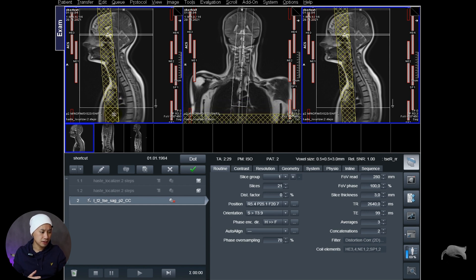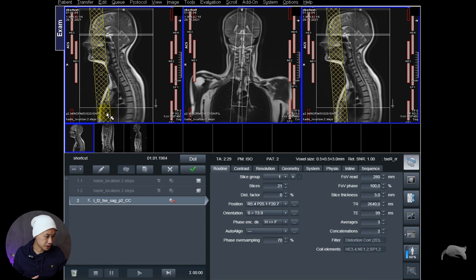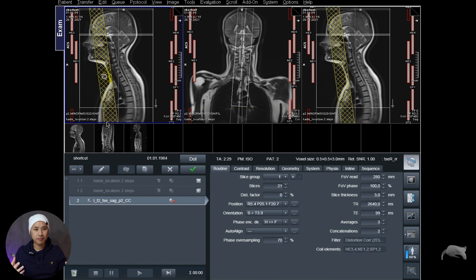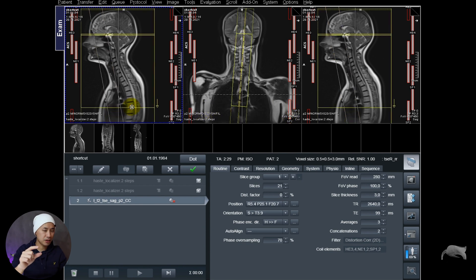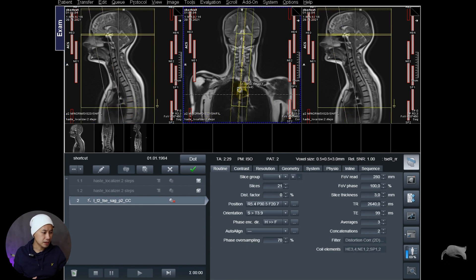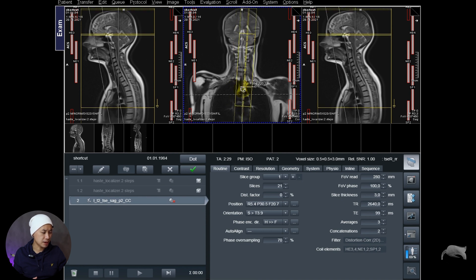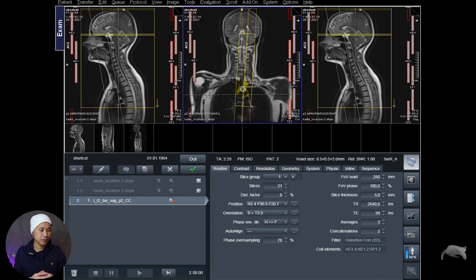When I hold Shift, I get another icon — as you can see, there's a rotation icon and a movement icon at the same time. So it's very fast; you don't need to push here, move your mouse, push back. It's so fast and easy — you can angulate and move your box at the same time by simply holding down Shift and moving with your left mouse button.